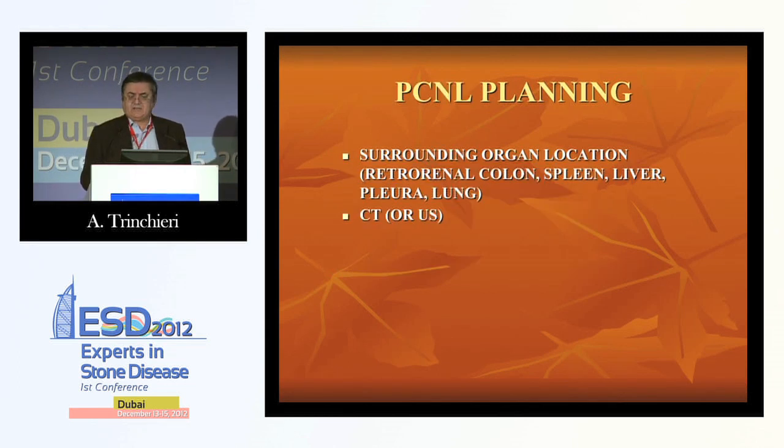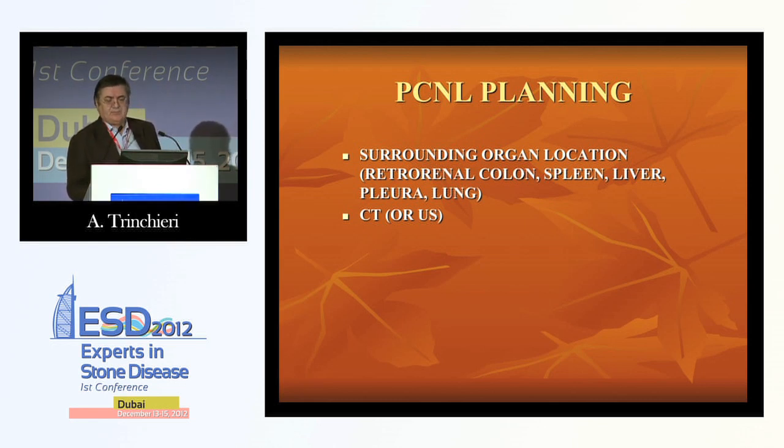For percutaneous nephrolithotomy, it sometimes could be useful to have information about the position of the organs surrounding the kidney, in particular in order to avoid lesion to the colon or other organ.